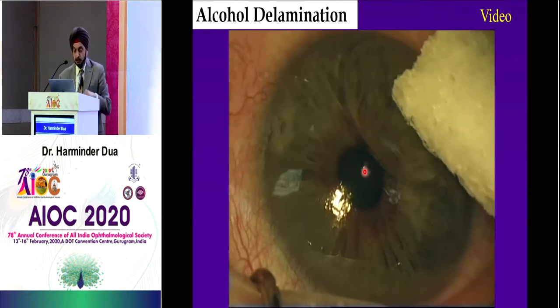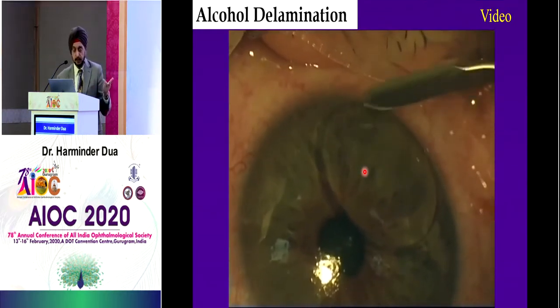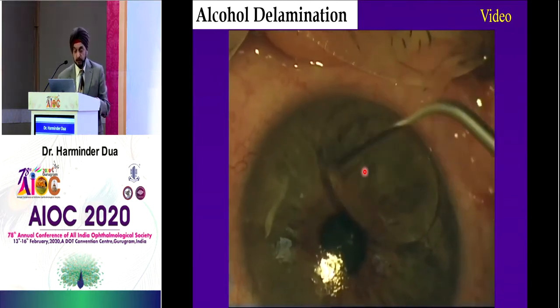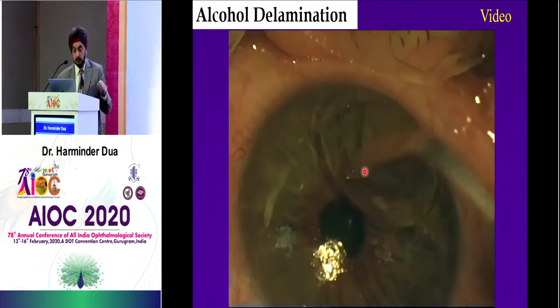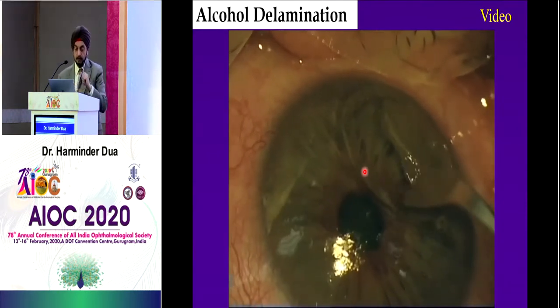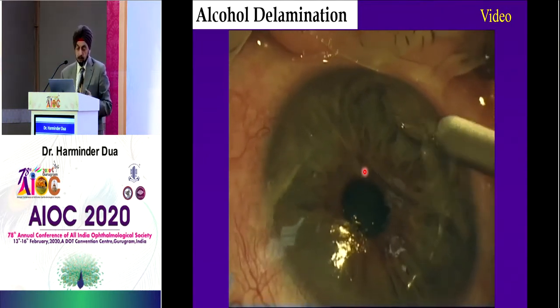Now you can see how loose the epithelium is — it's wrinkling, just to demonstrate that. Then you take any instrument: a dry swab, a crescent blade, a hockey stick, anything, and you can gently peel off the entire epithelium. It's almost like an epitheliorexis — it'll come up along the circumference of the mark you have made, and you can take it out.